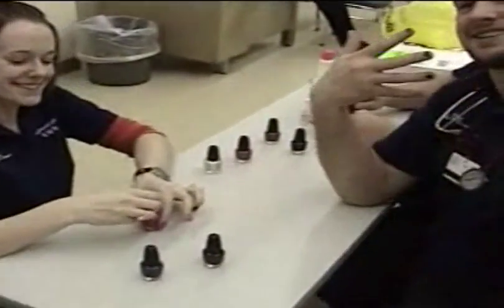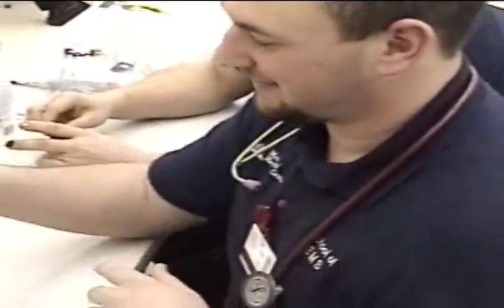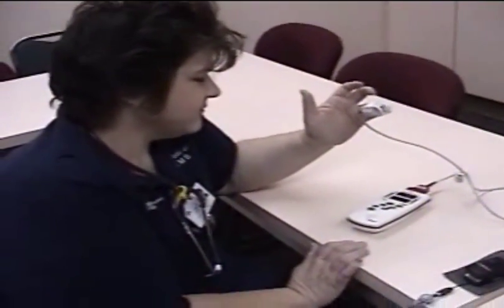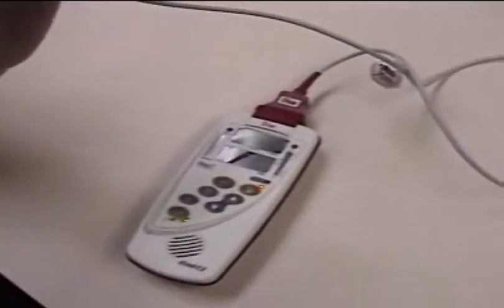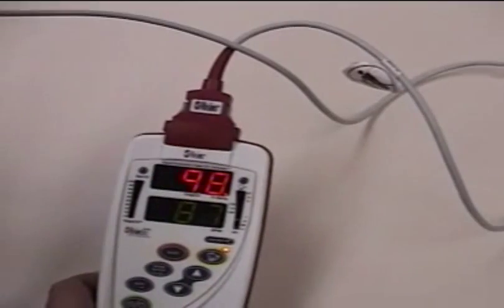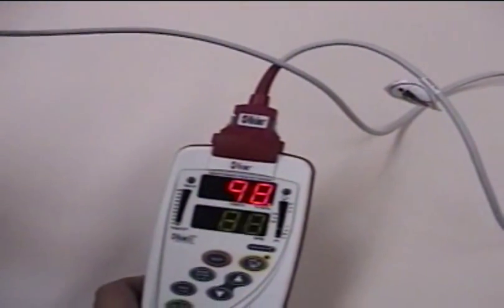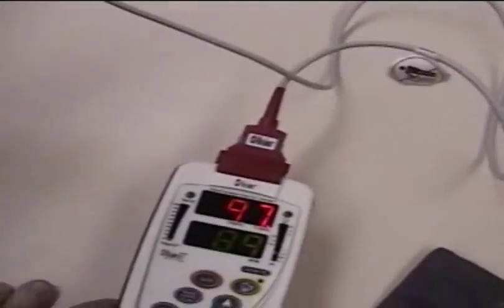The crew's already in Cody. We're using the Massimo Rad 57 and we're just getting a baseline right now. This is with no fingernail polish on — a pulse ox reading of 98%.